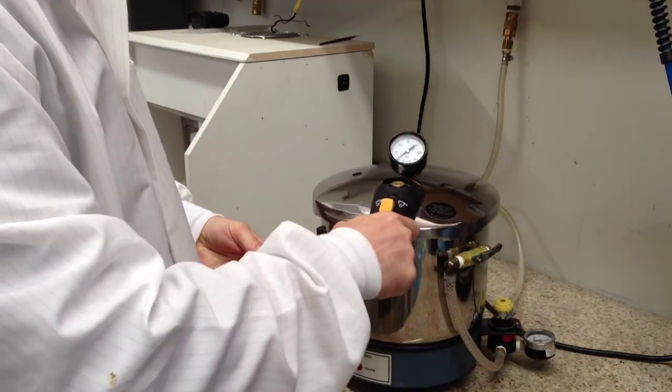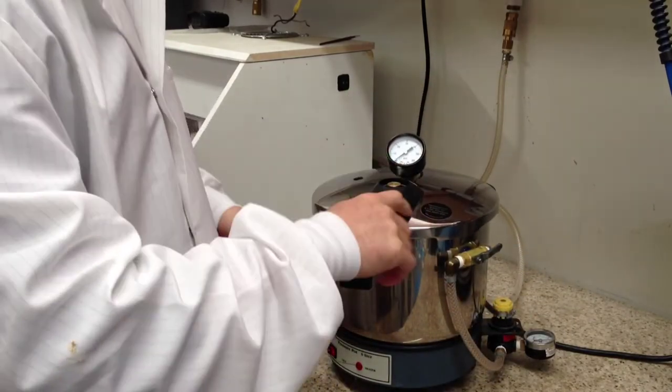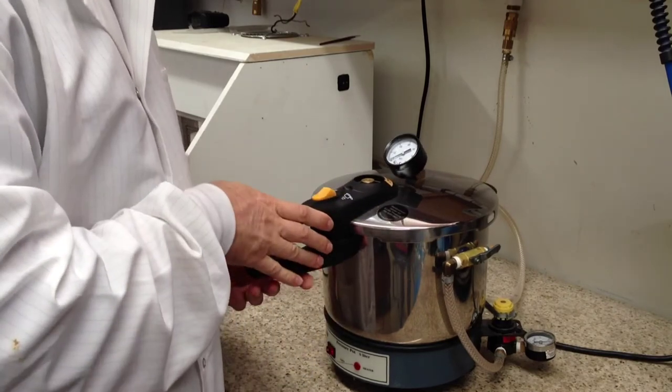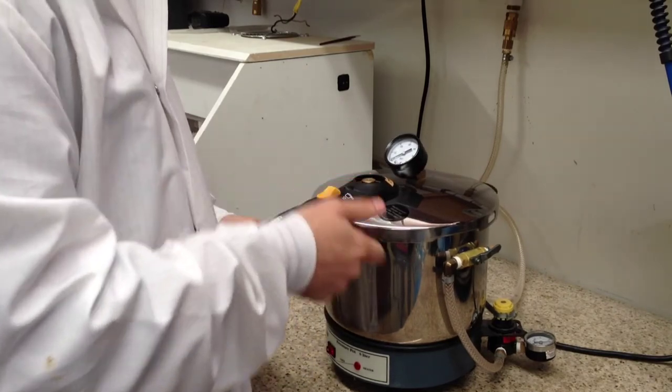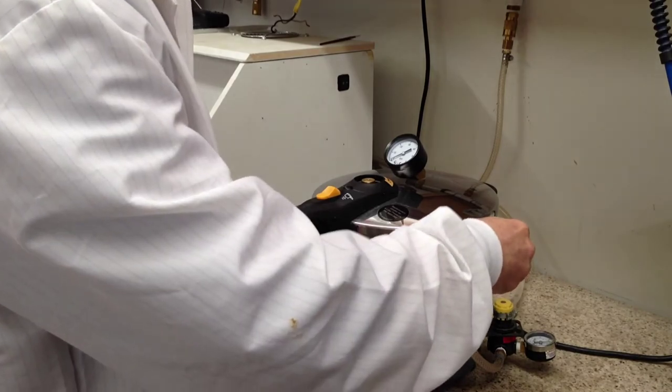You are going to close the lid, lining up the hash marks to get the proper seal. You will close it, flip the lock forward, and then apply the air.